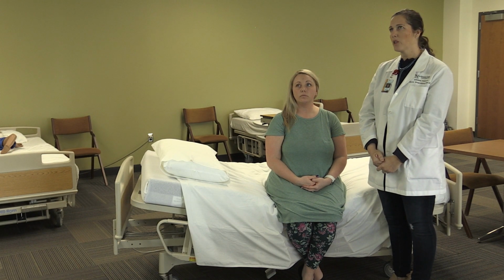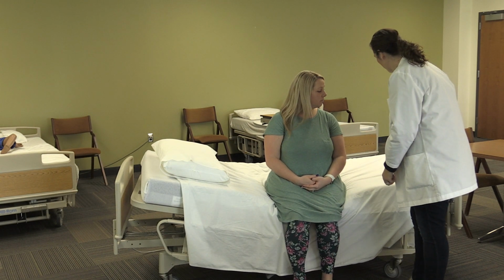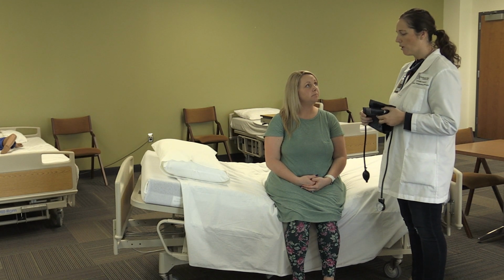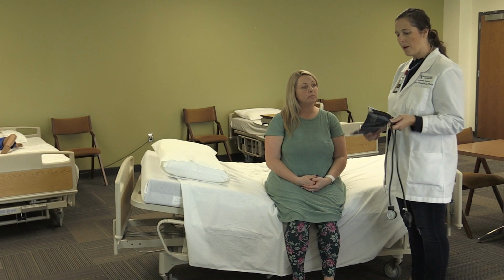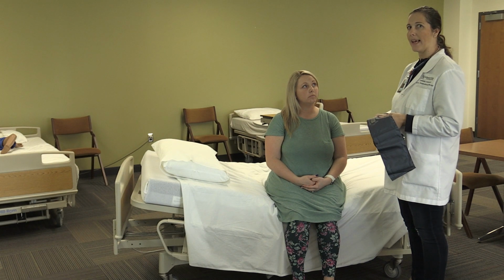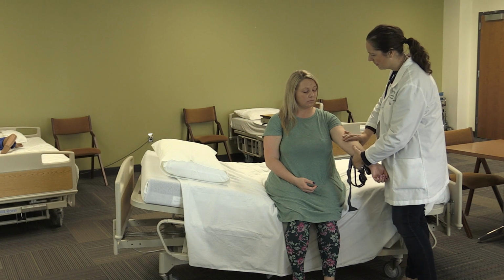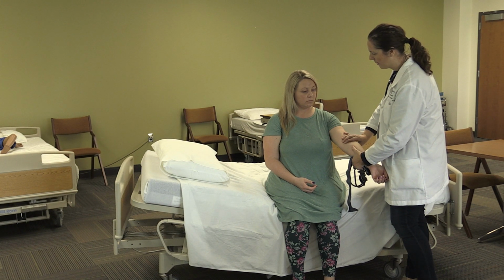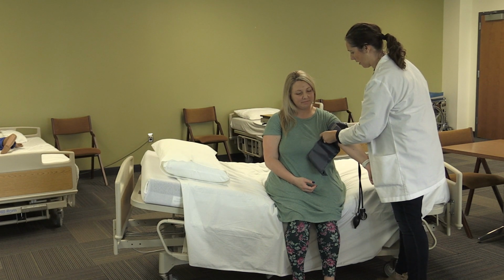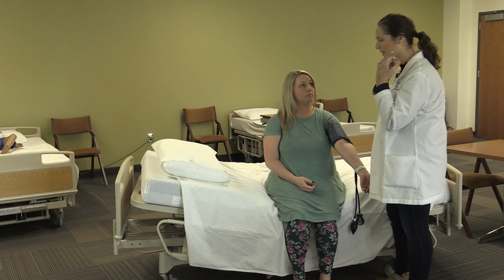The very next thing I'm going to do is measure her blood pressure. So, Erin, if you could tell me what your normal blood pressure is? Right around 120 over 80. 120 over 80. So I'm going to go ahead and pump my cuff up about 30 points higher than that. I'm going to palpate for the brachial pulse, and that will help me know where to line up my artery marker. I've already measured my cuff, and I know I have the right size.